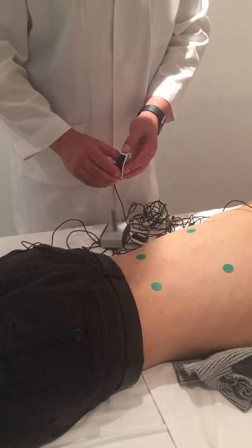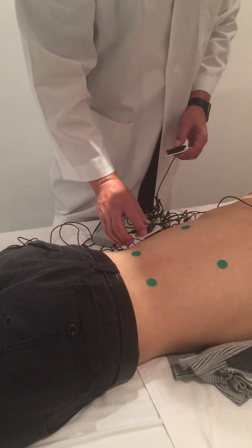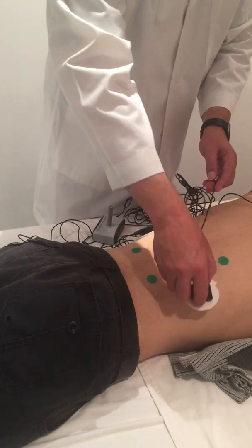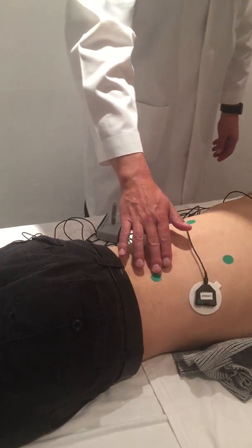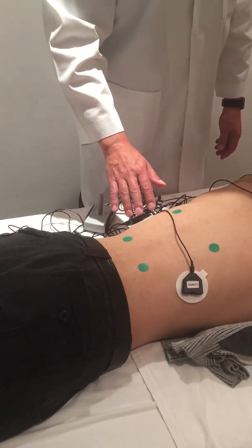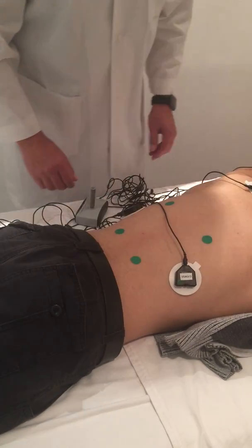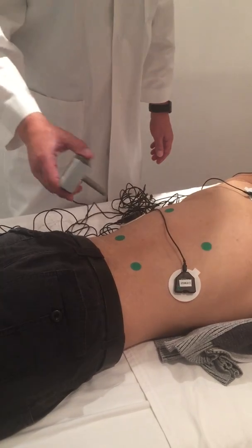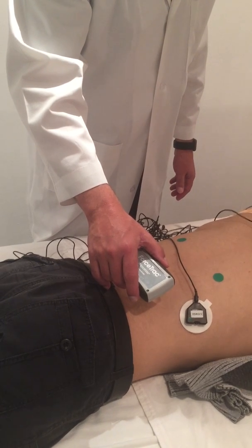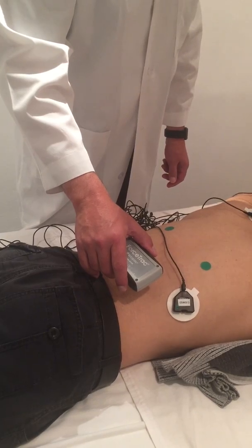Again, EMG3 and EMG4 are then to be placed near our testing site. Ideally, we want these to be placed near the symptomatic and control site, and ideally to have them at similar locations on opposite sides of the body if possible. When we do the test, we now have a spot where we know we're going to be able to apply our pressure and measure his physiologic response to tenderness.